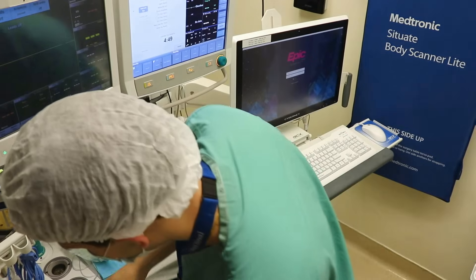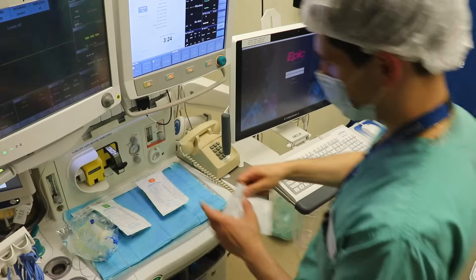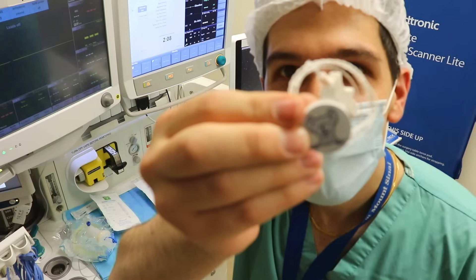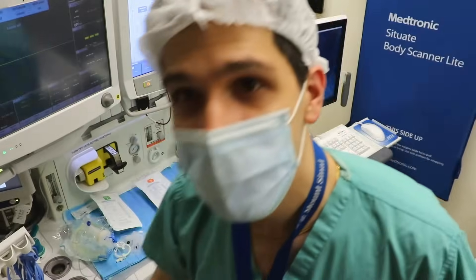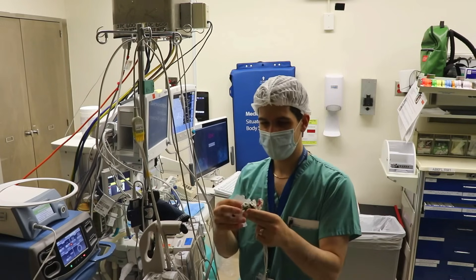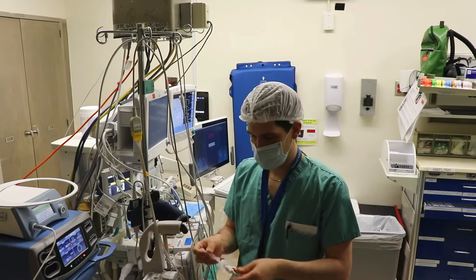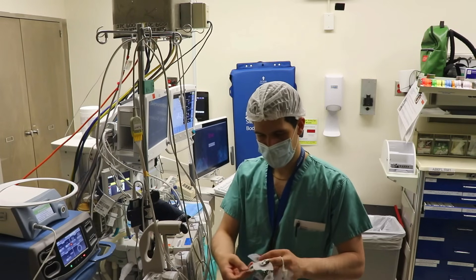We move along to the next letter, M again, this time for monitors. I'm going to get my American Society of Anesthesiologists standard monitor setup. I've got five EKG leads, a stick-on temperature probe that can also be inserted into a patient's nostril, a blood pressure cuff, capnography for end-tidal CO2 monitoring, and pulse oximetry bundled in with the EKG leads. I like to get my EKG stickers attached to the cables so I can quickly attach them once a patient comes in — but watch out, once attached they can very quickly become tangled.